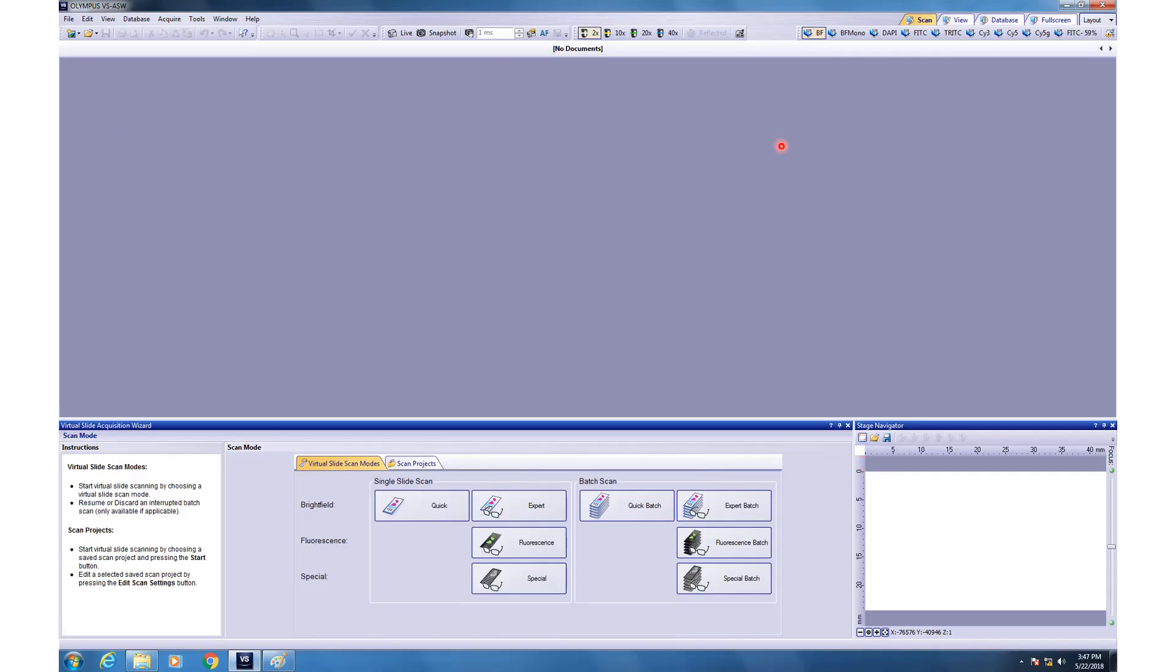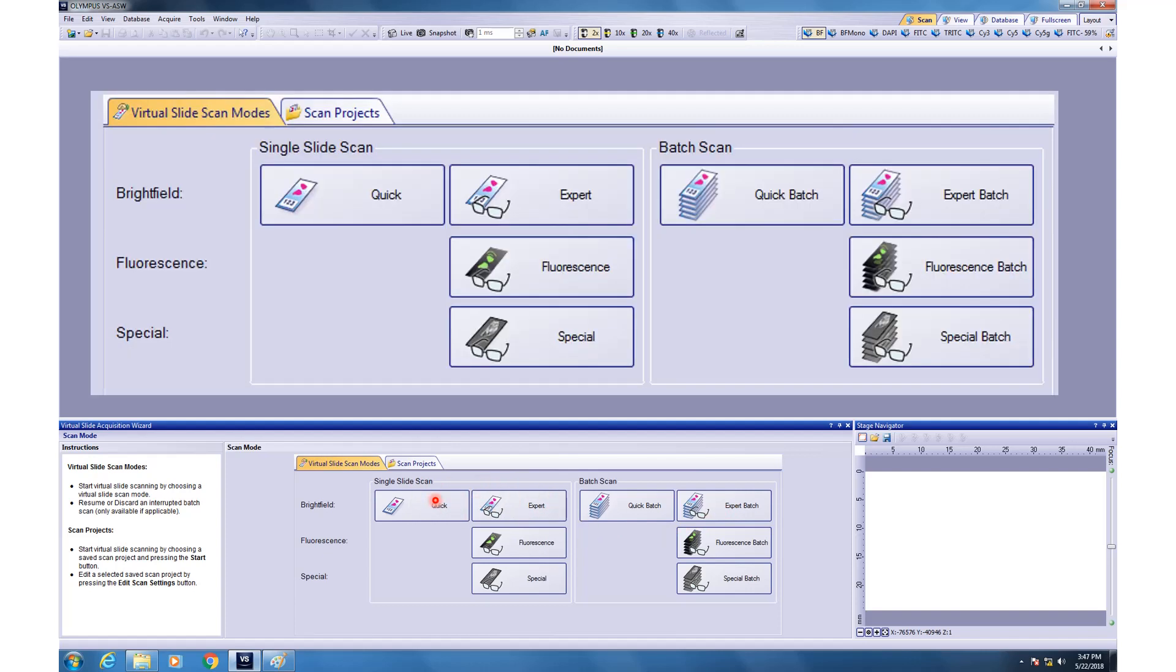This is how the software interface will look like. There are a lot of tiny buttons. Don't worry about them. The major area which we will be focusing upon is this area. For now, we will be doing the single scan mode. If you zoom in, this is how it looks like. So, single slide scan or batch scan. First, we will do single slide scan. Once you have mastered this area, then we move on to the batch scan. So, for now, we will click on expert.